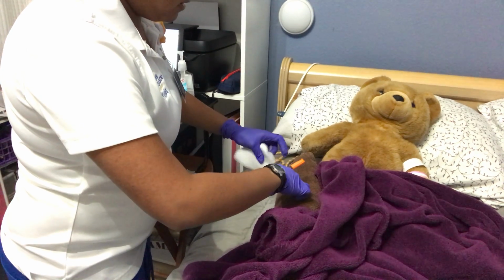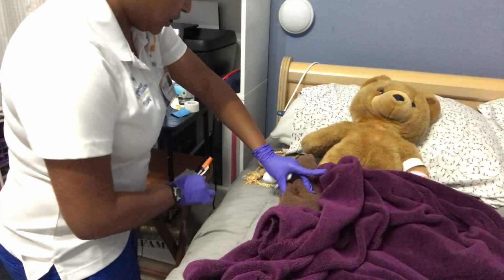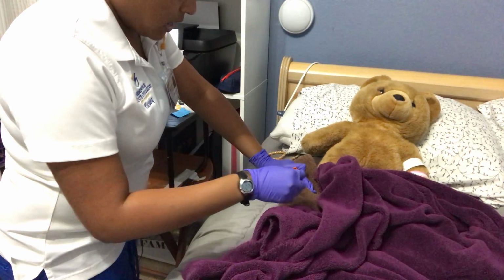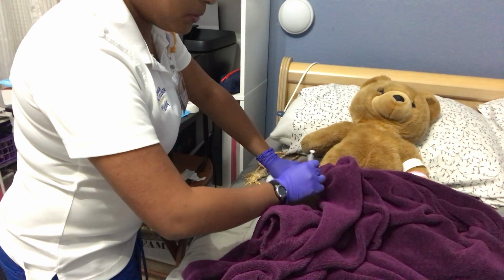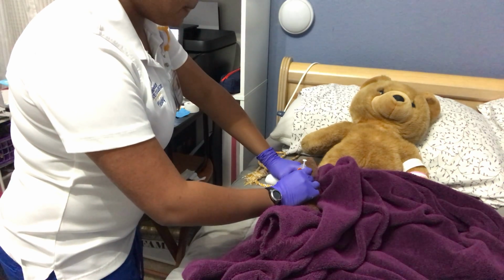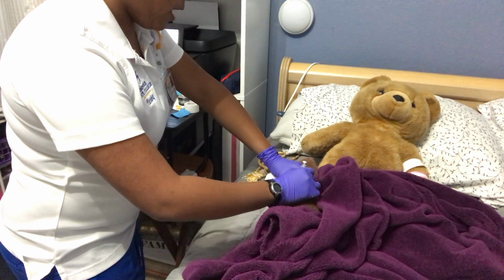And next, I'm going to grab it. And then I'm going to pinch it. I'm going to take off the alcohol pad that I just cleaned. Take off the cap. And then I'm going to dart it at 90 degrees since he does have enough adipose tissue. Alright. And I'm going to slowly put it into the leg. How are you feeling, Mr. Simpson? I feel okay. You feel good?